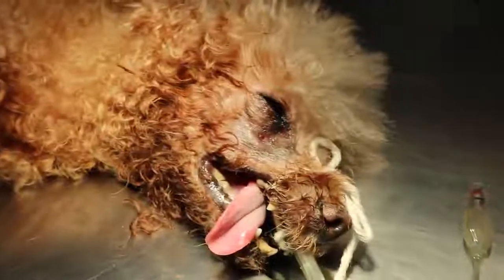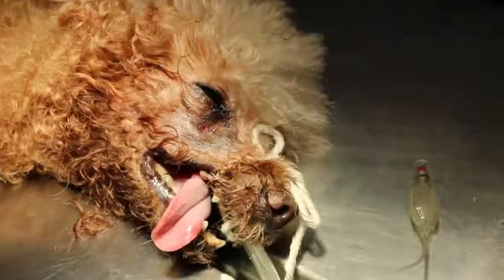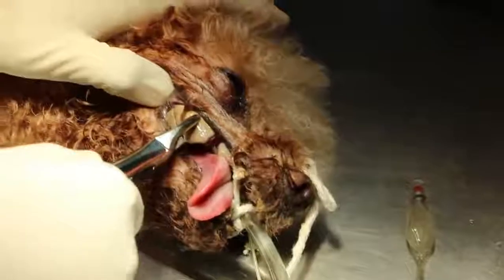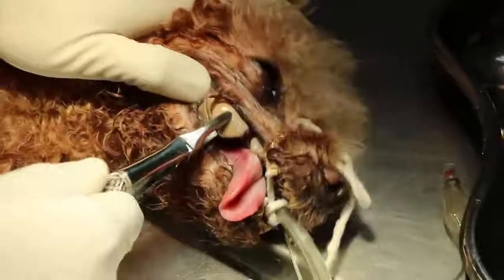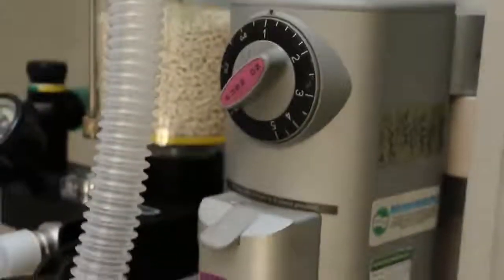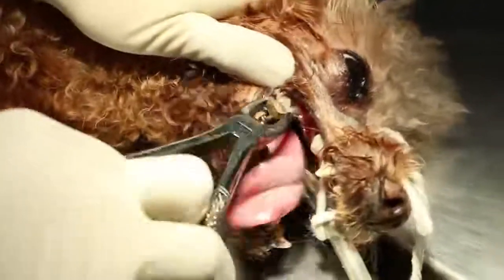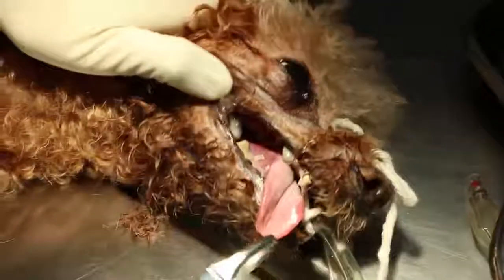Get the container to put the teeth in. This is the premolar 4. The anesthetic gas is 1%. PM4 — write down PM4. This is M1, right down M1, right upper.